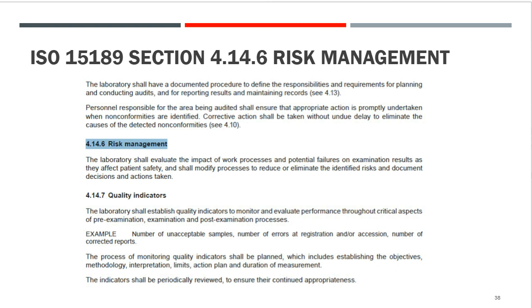Be aware also of other terminology that ISO uses, especially if you're accredited to ISO. When an ISO document says shall, that's a requirement. It's non-negotiable. You will do any sentence that says shall. If you don't do this, you won't pass your accreditation, whatever the sentence is, if it contains the word shall. Alternatively, there are places where it will say should, and those are optional. They're suggestions. They're not required, but they're usually the smart thing to do. So I just want to distinguish shall and should because ISO has very specific definitions of those, and you need to work with those.